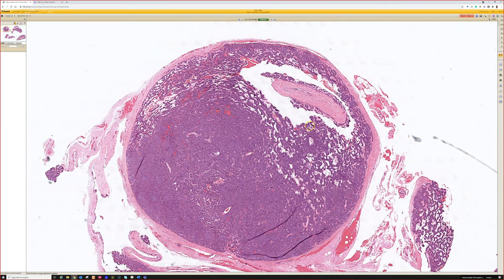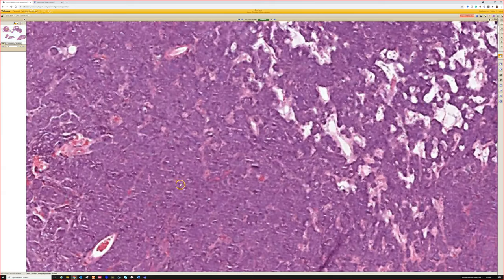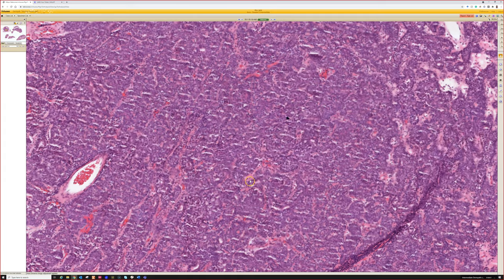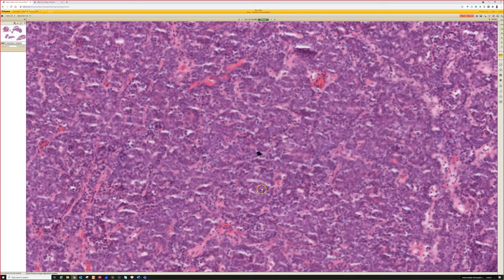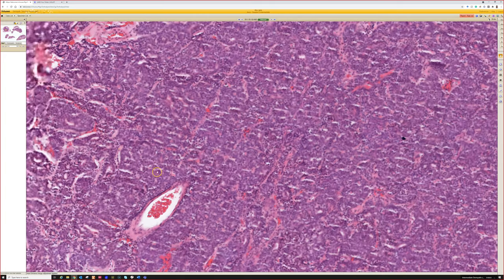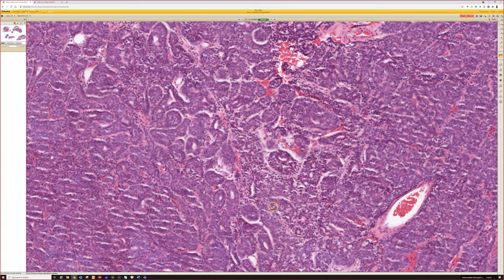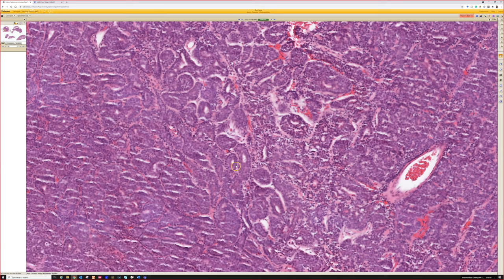Yeah, this is spiradenoma, blue balls in the dermis, right? Nice, sharply circumscribed nodules made of blue cells. The cells look very similar to those of cylindroma. Spiradenomas, though, tend to have a scattering of lymphocytes. Unfortunately, this scan is not very good at high power. It's kind of hazy for some reason. But usually you'll see the two different types of smaller, darker cells and then the bigger, lighter cells, plus a scattering of lymphocytes.